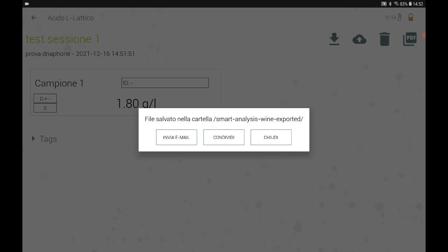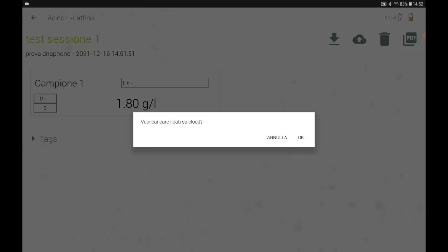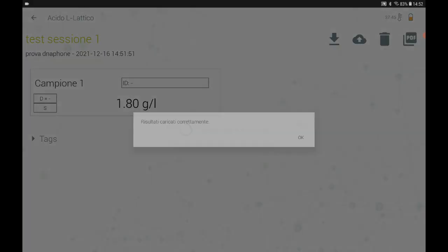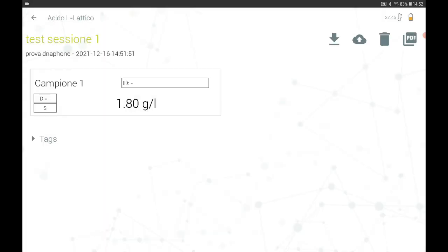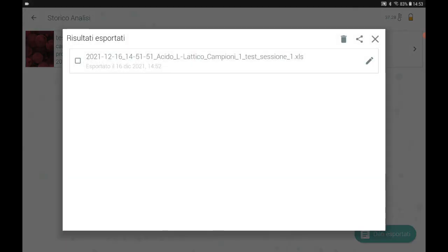The last option is to upload the results on your cloud page. Once you have uploaded them, you can review them by accessing cloud.dnaphon.it. Go back to the main archive screen and at the bottom right you will find a green folder containing all exported Excel files. From here you can select the ones you are interested in and share them in a single email.